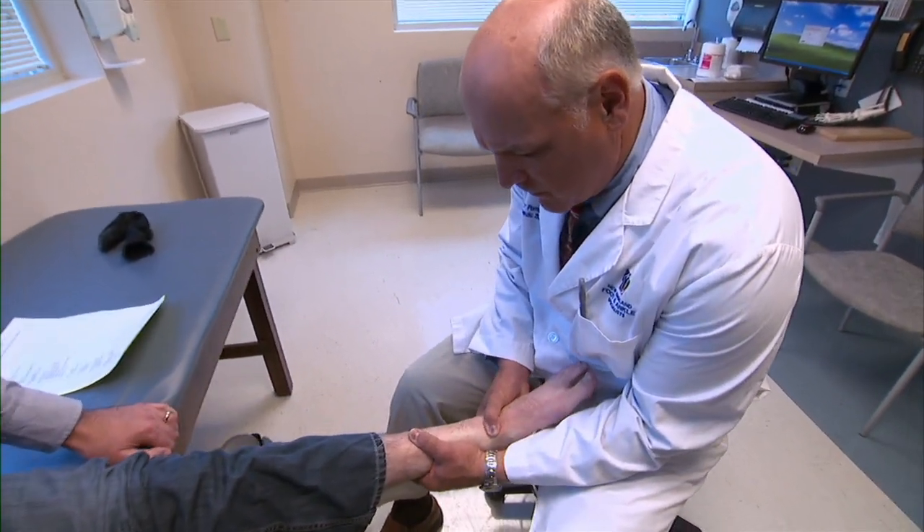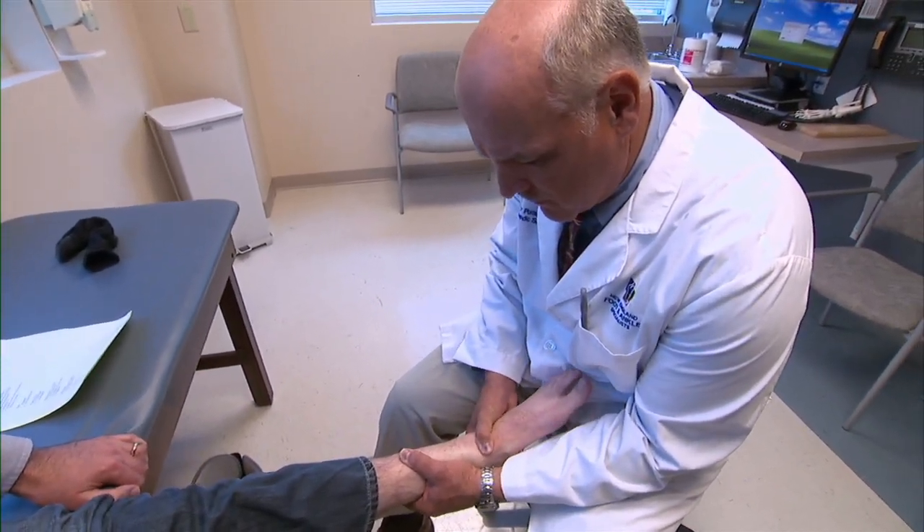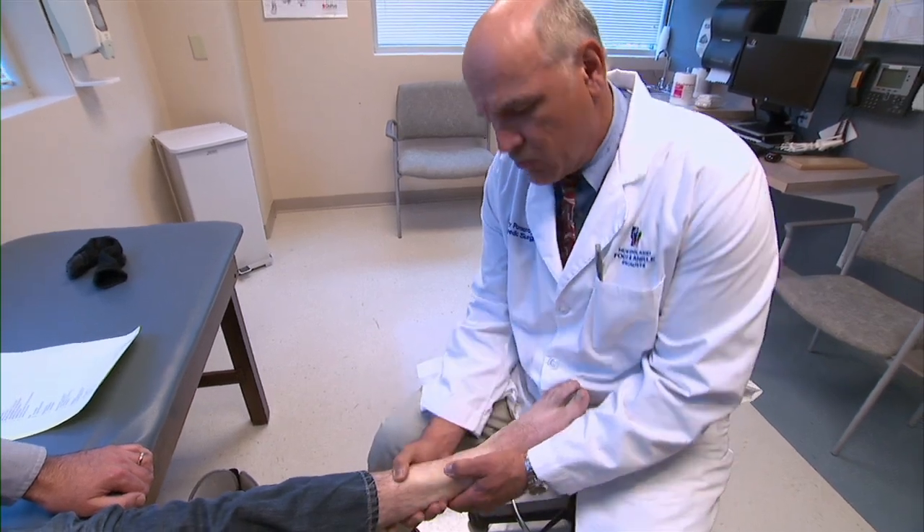Patients should discuss all noninvasive stimulation product risks with their surgeon. Having bone growth stimulation allows physicians yet another tool to help successfully treat fractured nonunions in a difficult group of patients. Biomet's bone stimulation devices are sold only by prescription and only your doctor can decide whether one of these devices is an option for you.